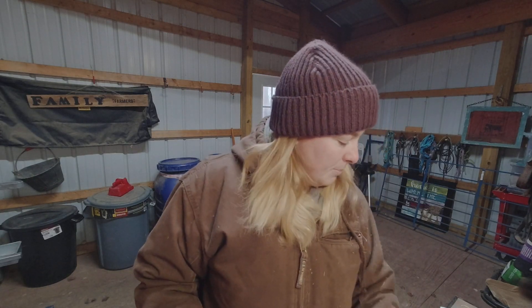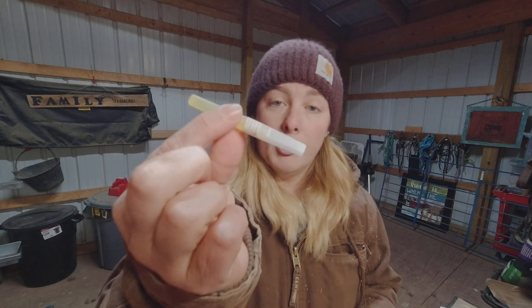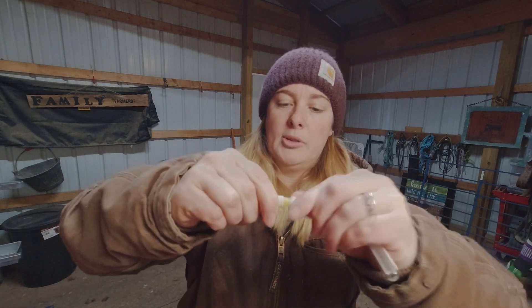Another method uses supplies you can get from many labs. I'm using UBRL — the Universal Biomedical Research Laboratory — for my tests. On their site I can buy different materials and supplies. I do use them for the red top tubes, which are really important because they're vacuum sealed — this is what holds your blood sample to send to the lab. My red top tubes came with a needle holder and a double-sided needle. You just give it a twist to assemble the needle holder.